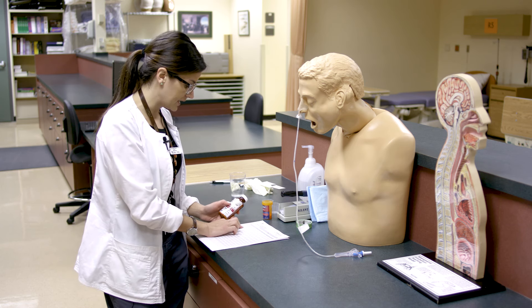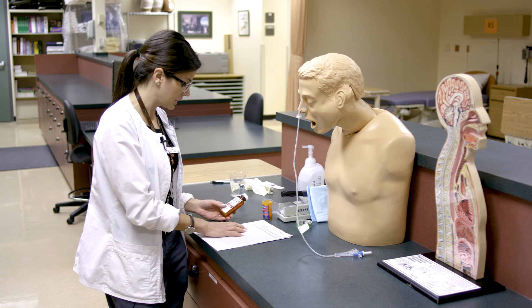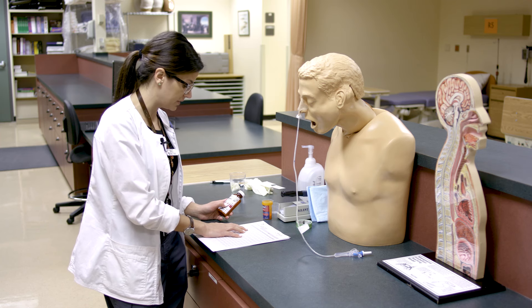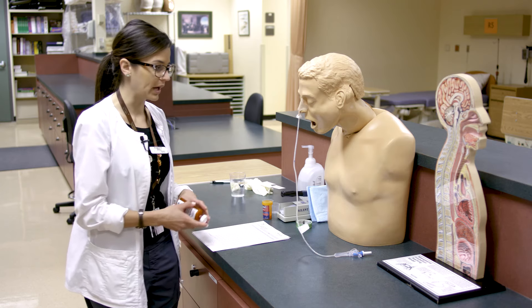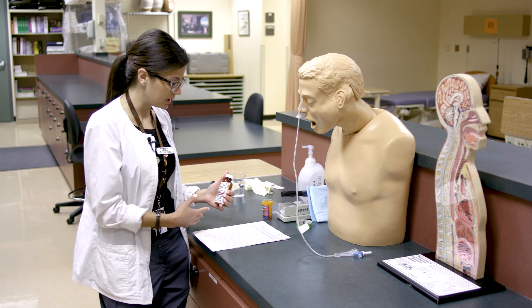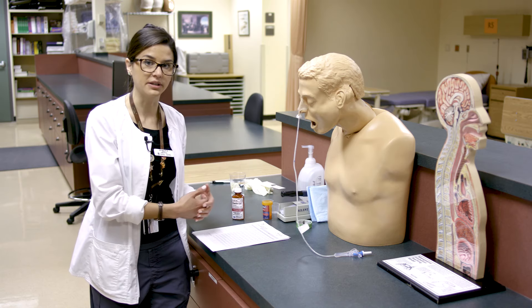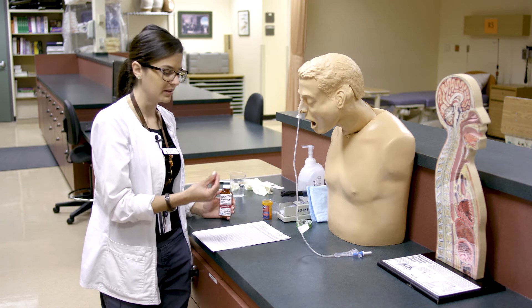The second medication is Dilantin. Dilantin 125 is a suspension, so we'll need to shake it to disperse the medication. It's 125 mg per 5 mLs and the order is for 250 mg, so we need 10 mLs. Because it's a liquid, that's ideal for NG tube delivery. It's a good idea to ask the pharmacy team if any medications can be changed to liquid, as it helps prevent clogging of the tube with crushed pill remnants.